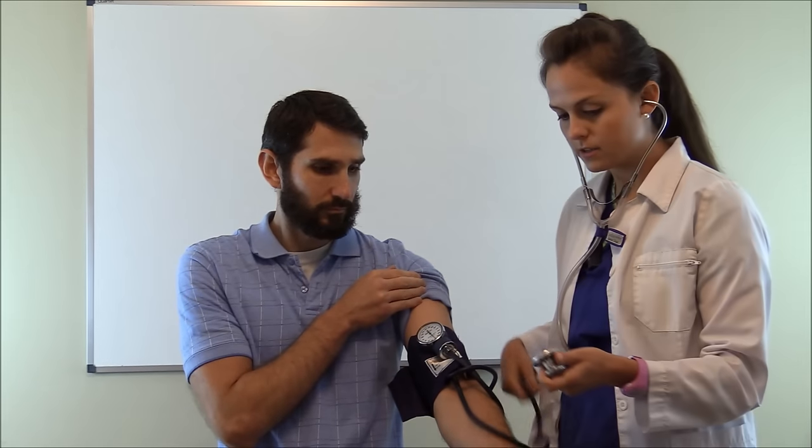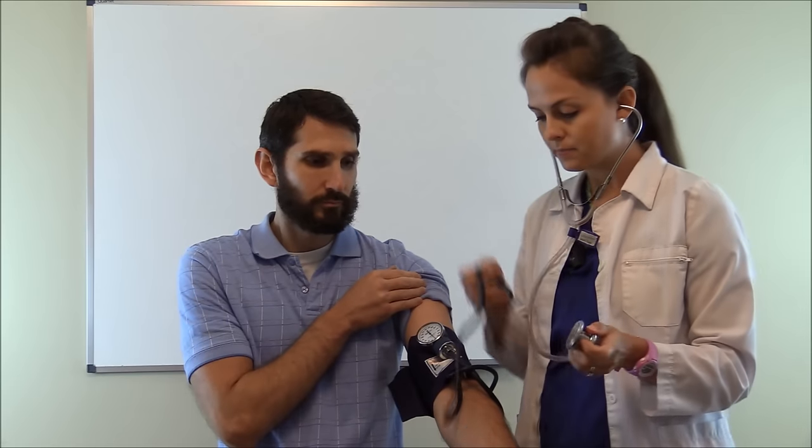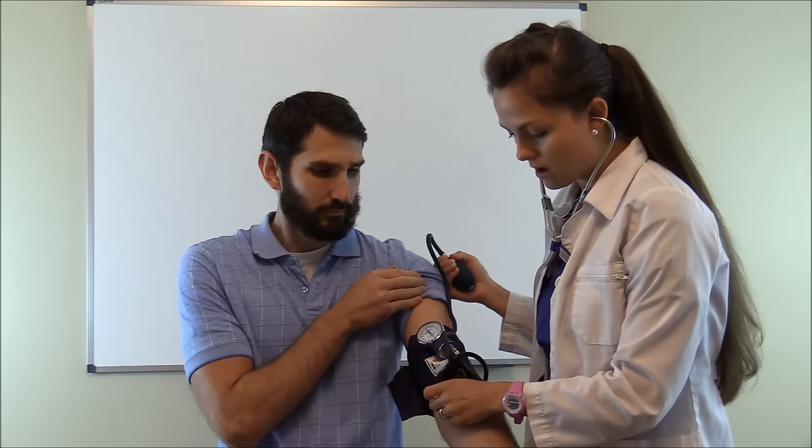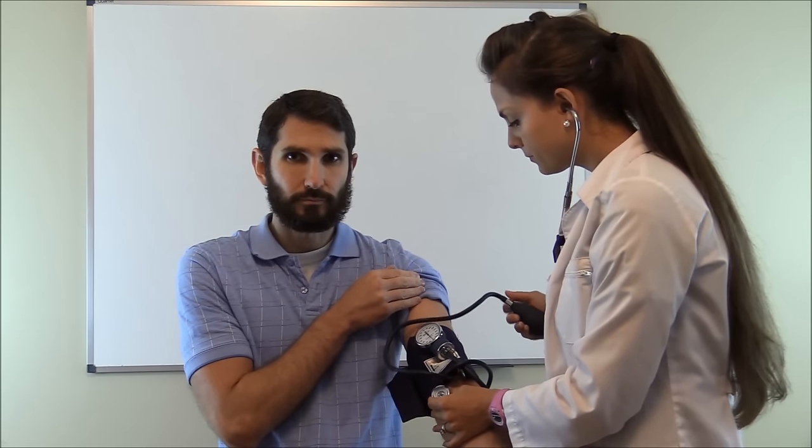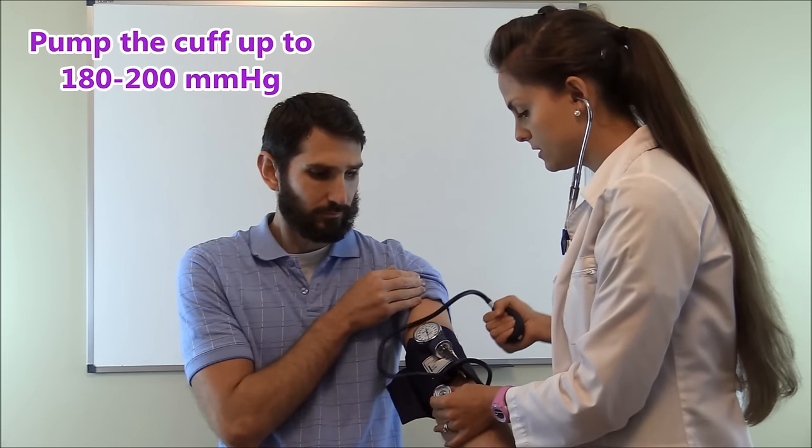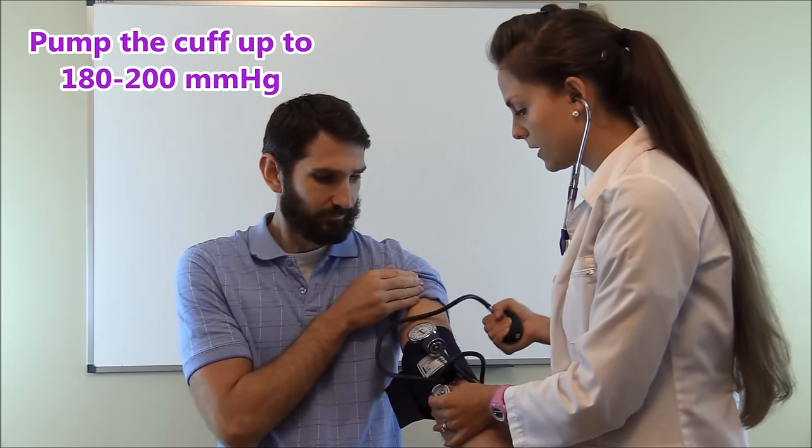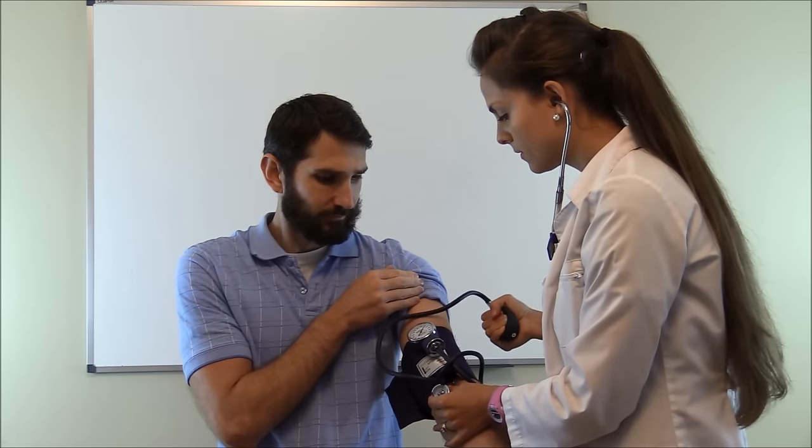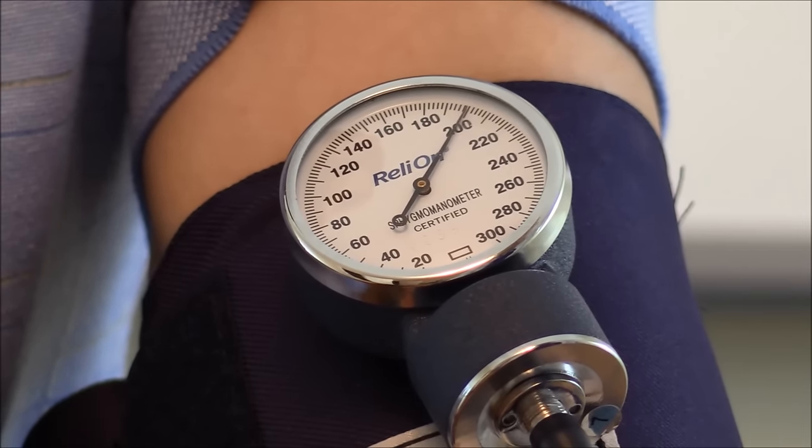Put your stethoscope in your ears and you're going to use the diaphragm of your stethoscope and you're just going to place it over where you heard that brachial artery. Then you're going to blow the cuff up to about 180 to 200 millimeters of mercury or until you don't hear that brachial artery anymore. We're blowing it up to about 200 millimeters of mercury.